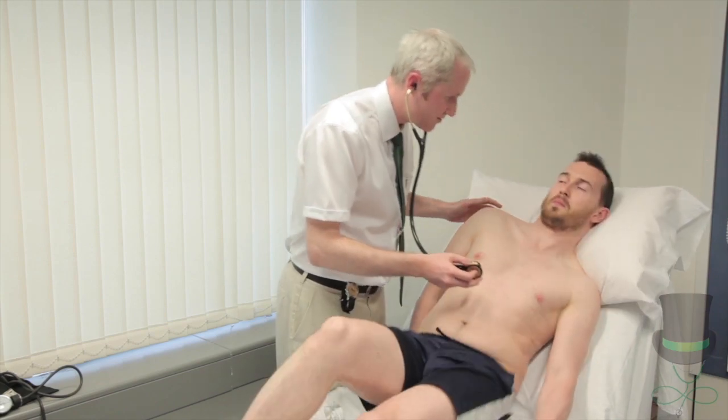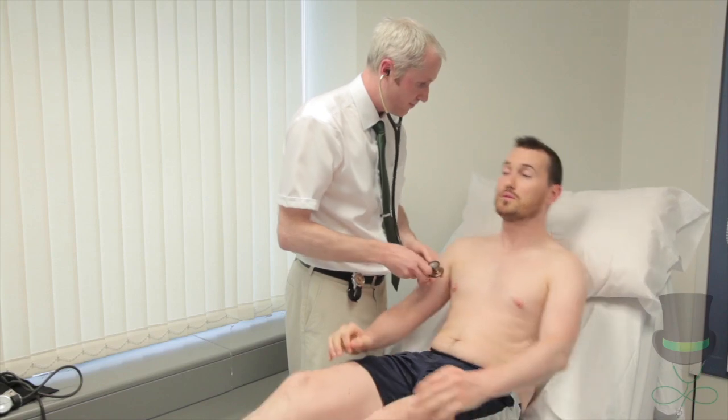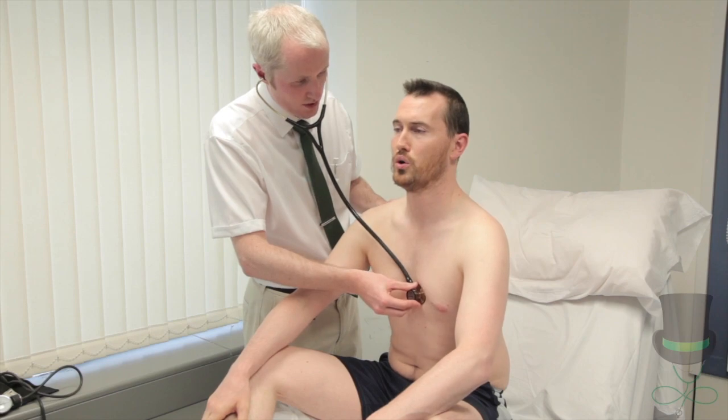That's fine, you can breathe. Move over to your left side. When you're ready, go all the way out and hold it out.